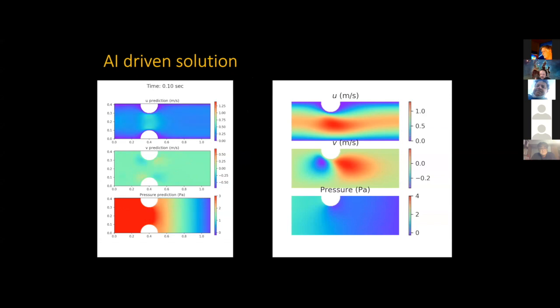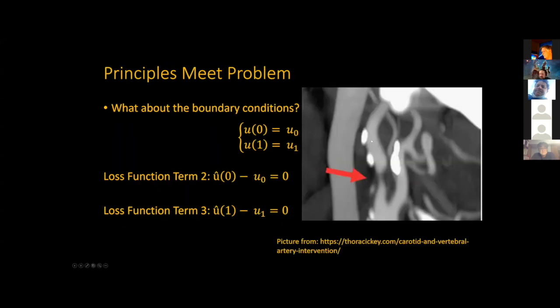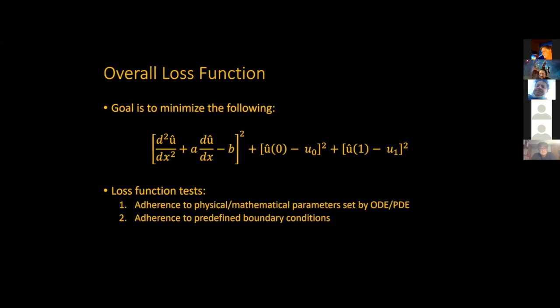And imagine, until now, these are simulations, by the way, but imagine until now, in order to extract this kind of velocities, you put it into something called computational fluid dynamics, which can take 48 hours to calculate. What about having something like this? As soon as you upload your data into the surgery, you upload a picture like this, it starts calculating those values and tells you what is happening. So we're moving even one step further when we can do physics-informed artificial intelligence.